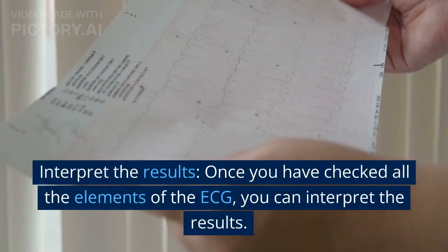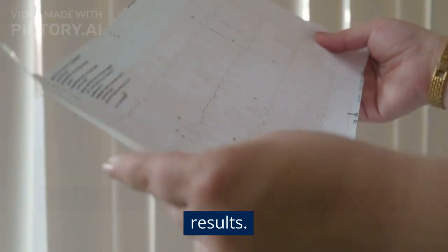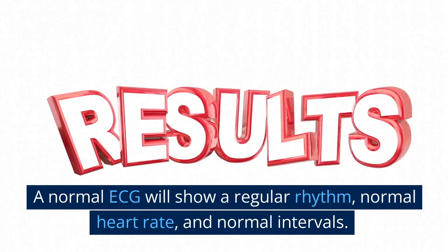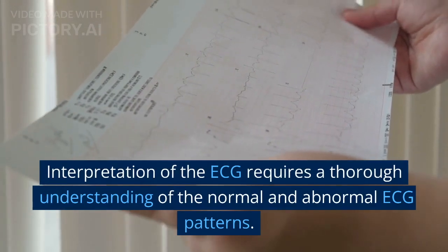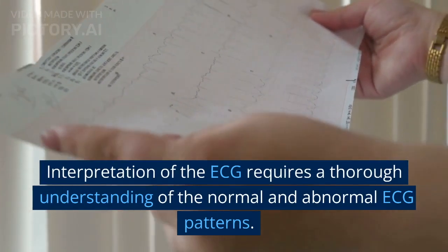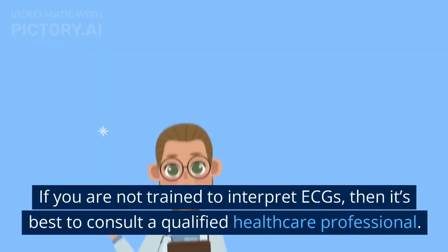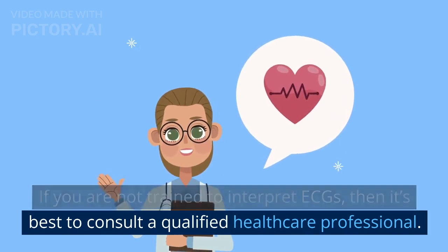11. Interpret the results. Once you have checked all the elements of the ECG, you can interpret the results. A normal ECG will show a regular rhythm, normal heart rate, and normal intervals. Interpretation of the ECG requires a thorough understanding of the normal and abnormal ECG patterns. If you are not trained to interpret ECGs, then it's best to consult a qualified healthcare professional.